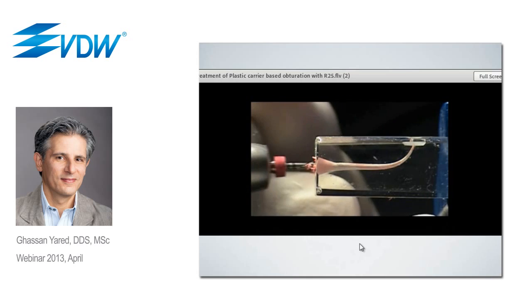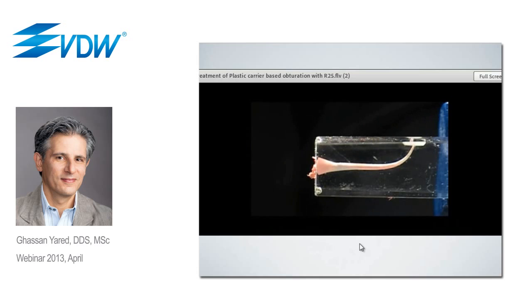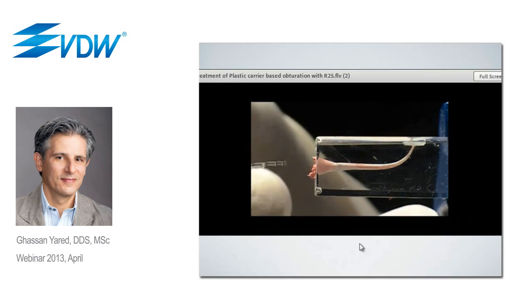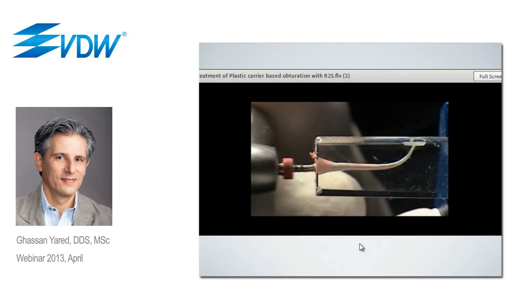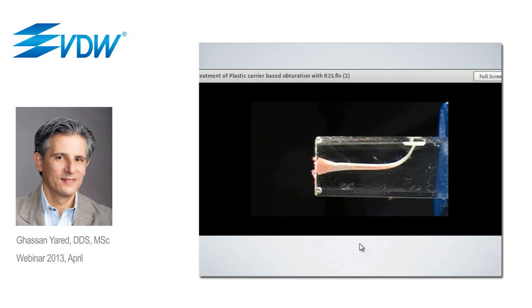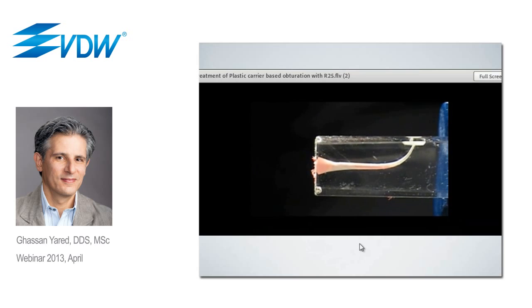that regardless of the type of treatment that we are doing, whether it is an initial treatment or a root canal retreatment, whether the canals are calcified or not calcified, severely curved or not severely curved, the technique is always the same. It does not change. And this is what makes it very simple, and this is what makes it very interesting for teaching purposes. It's an easy technique to teach and an easy technique to apply and to learn.